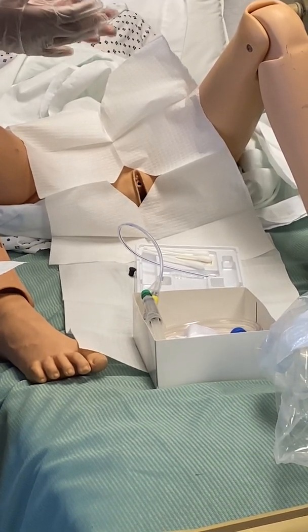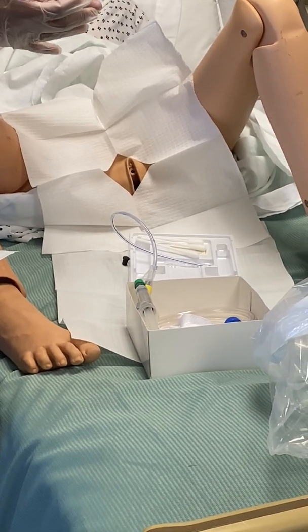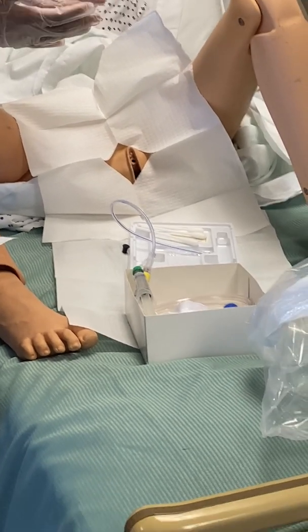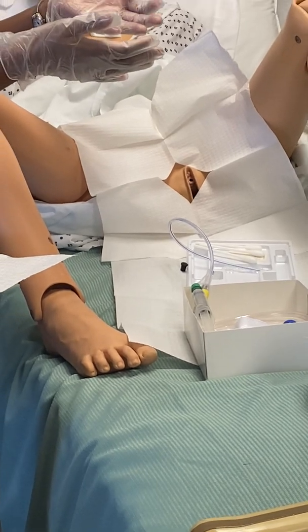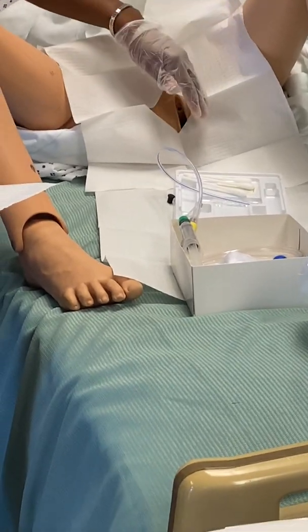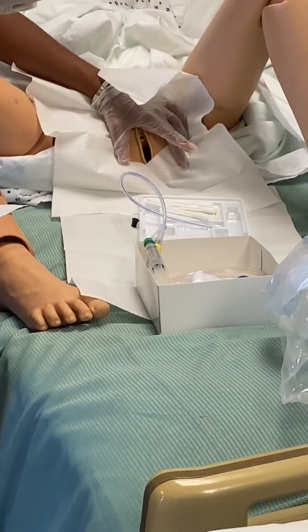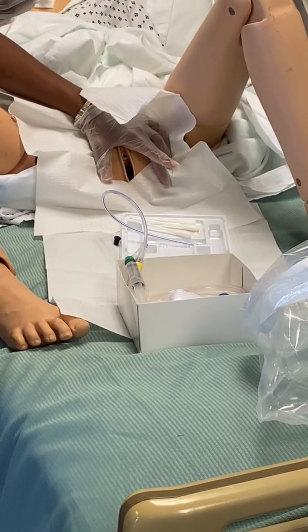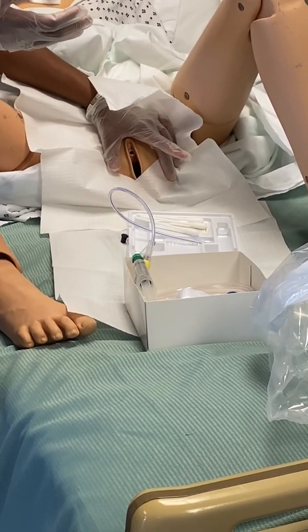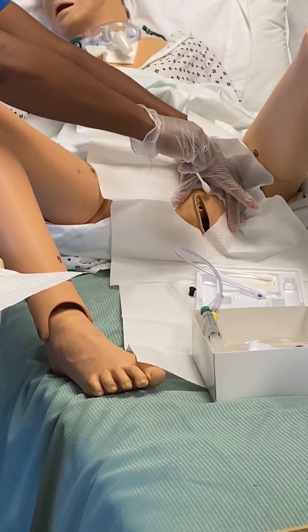Okay? So once I put my dominant hand on that vagina, can I move it again? My non-dominant hand? No. Make sure you put your non-dominant hand there, because if you're right-handed, can you work with your left hand? No. So you probably need to be on the opposite side of the bed. Okay? All right. So I'm going to put my hand here, and I cannot move this hand again. If you move it again, you will fail. I don't care who your instructor is. Okay? Now, so I've put my non-dominant hand there, and I'm going to clean my patient. Okay? I'm going to clean it from farthest away first.